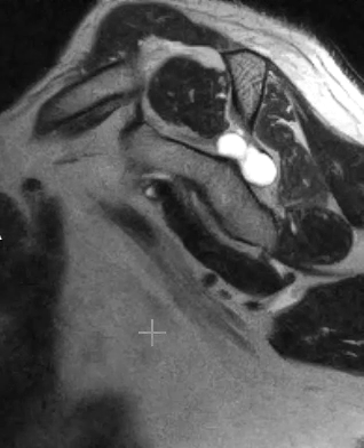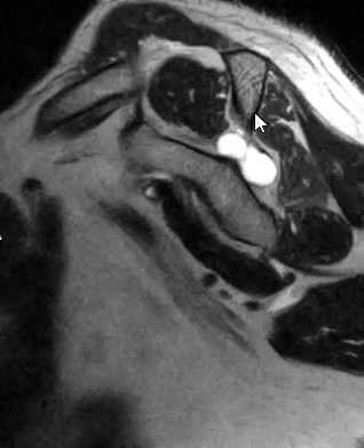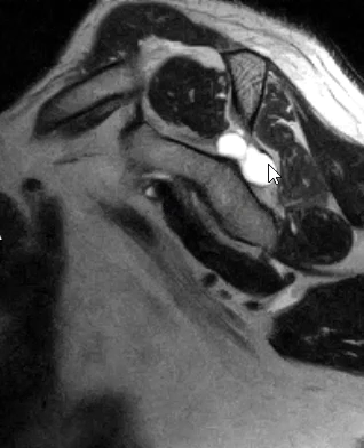In this view, if I window it just right, we can see in the front the subscapularis muscle, the supraspinatus muscle up top, and the teres minor muscle down at the bottom. All the muscles are nice and normal size, really jet black — but this muscle, the infraspinatus, is gray and maybe a little bit atrophic.